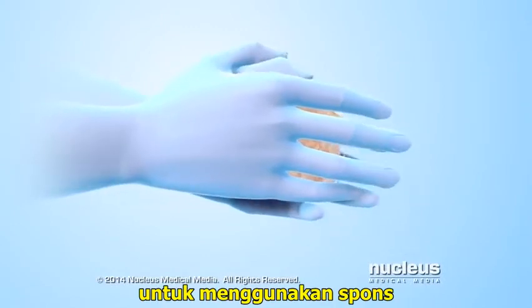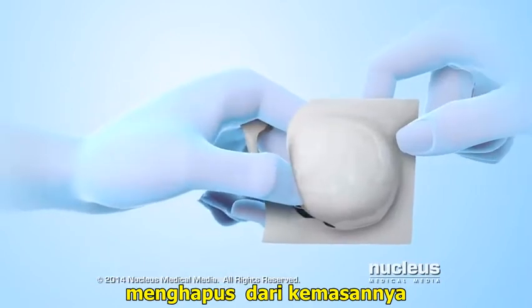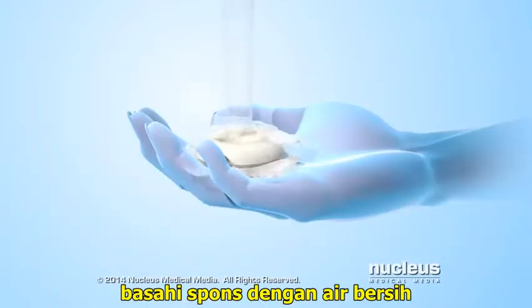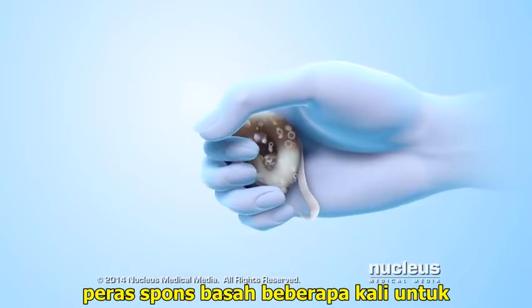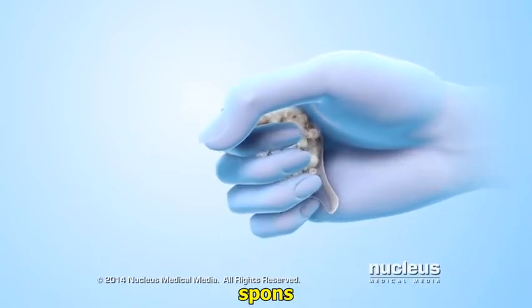To use a sponge, wash your hands and remove it from its package. Wet the sponge completely with clean water. Squeeze the wet sponge a few times to activate the spermicide inside the sponge.